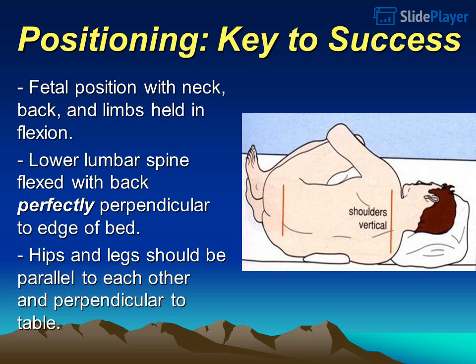Positioning, key to success. Fetal position with neck, back, and limbs held in flexion. Lower lumbar spine flexed with back perfectly perpendicular to the edge of the bed. Hips and legs should be parallel to each other and perpendicular to the table.